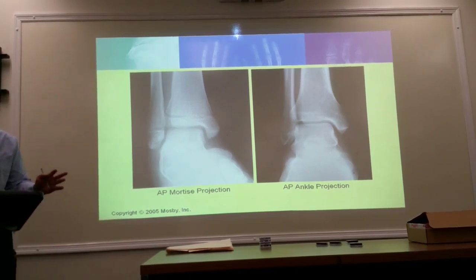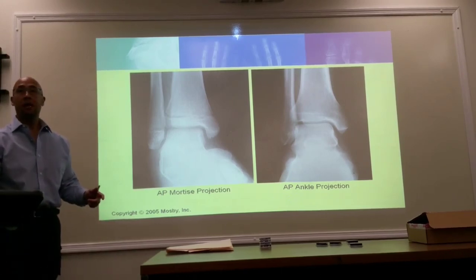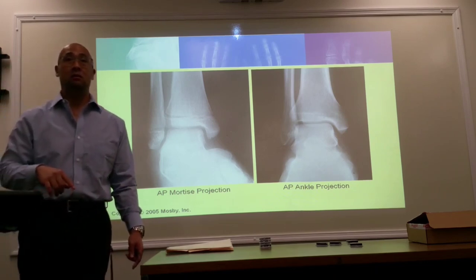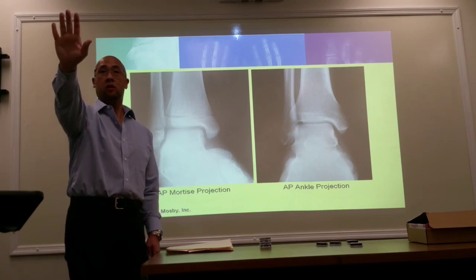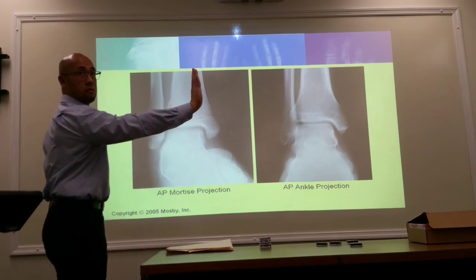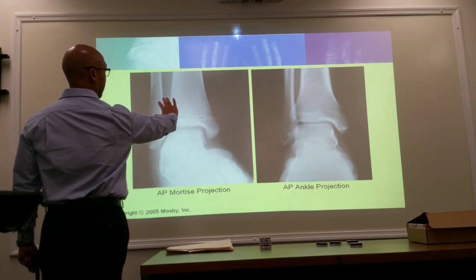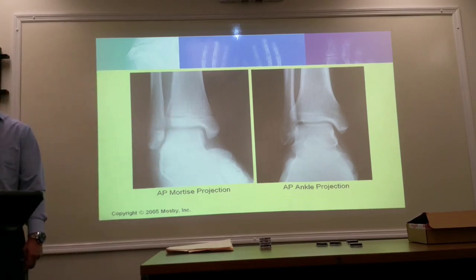Any questions? Yes. When you mean rotate, is that a medial deviation? It's just going to be medial rotation. So from here, it's going to be relaxed and turn in 15 to 20 degrees. So here's your AP, okay? It's going to be relaxed and then turn in 15 to 20 degrees medially. I'll cover that again.